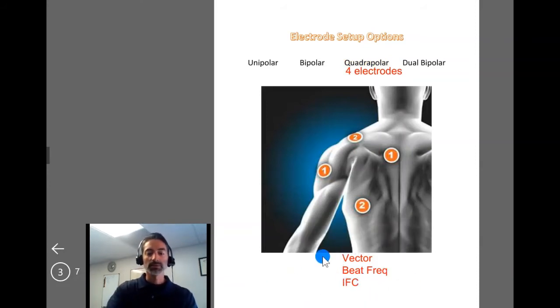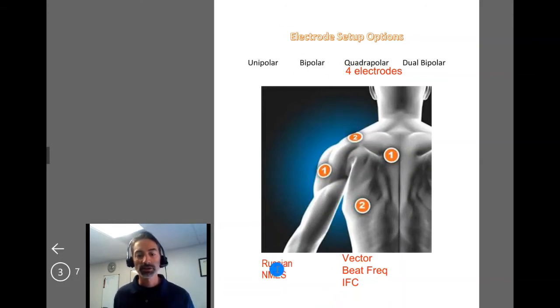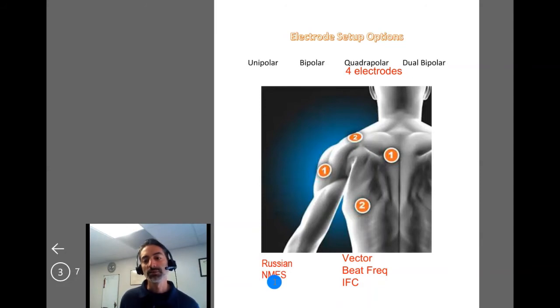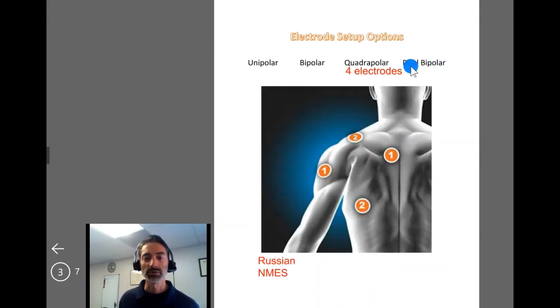You can also do a quadrupolar setup with Russian stimulation or NMES. You might set that up with four electrodes around the target area, or you might go over the quadriceps and hamstrings for more of a dual bipolar setup. There's some variation as to where you might apply that.